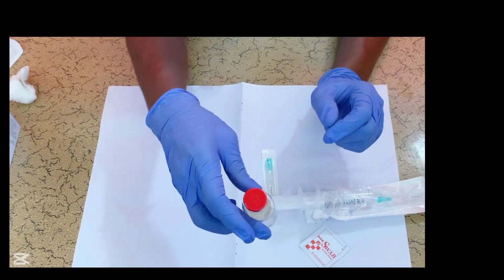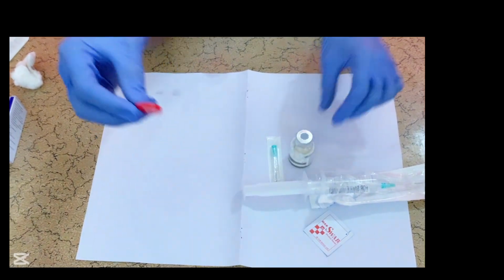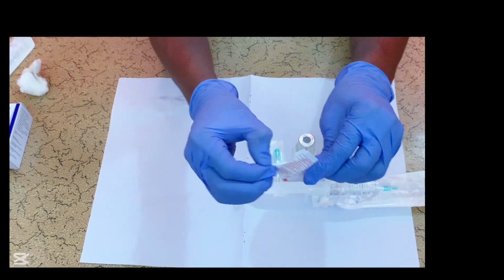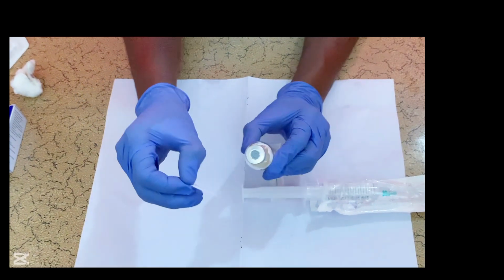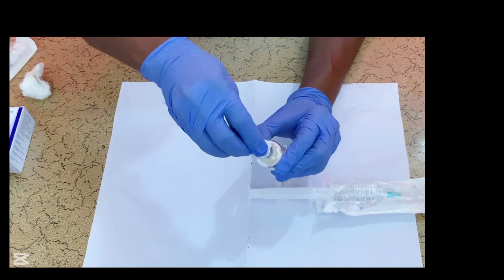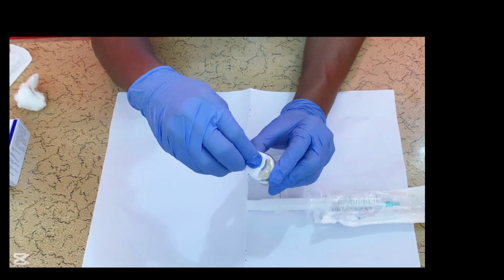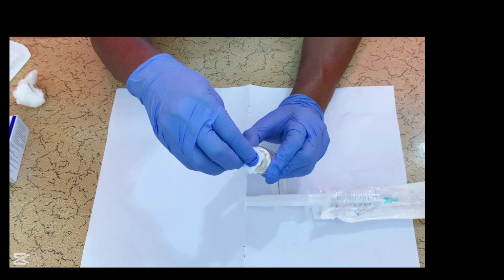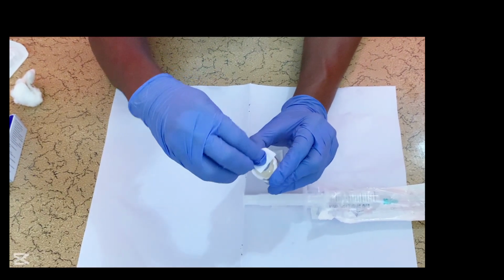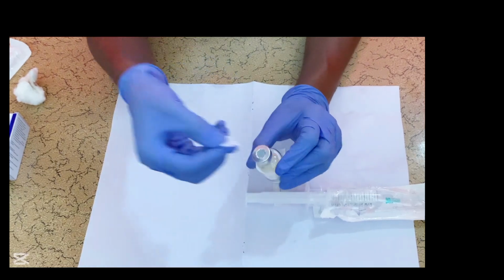Then you get the amoxicillin. Then you flip off the lid of the vial. Then you get an alcohol swab. So this is an alcohol swab. Then you make sure you clean the opening of the lid to maintain the sterility of the drug. Make sure you clean the opening of the vial for 20 seconds and you allow it to dry for 30 seconds.